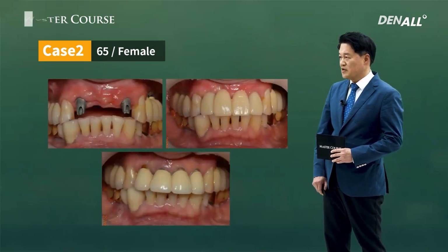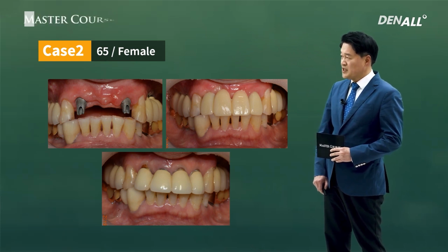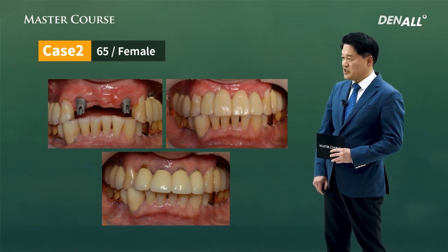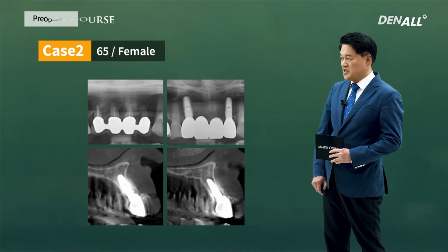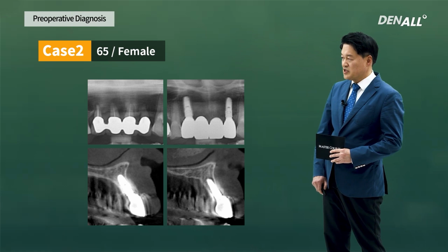Finally, the final abutment. The placement direction was not favorable, so a customized abutment, a one-fit abutment, was used, and the prosthesis was completed. As you can see, by recording a post-op image and comparing it with the pre-op image, the results are much more aesthetic, and you can share that with the patient and gain the trust of the patient, and patient satisfaction can go up. The X-ray was taken to compare before and after, and on CT, the GBR area on the buccal side is healing nicely.